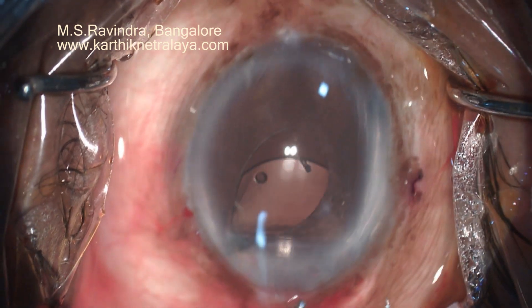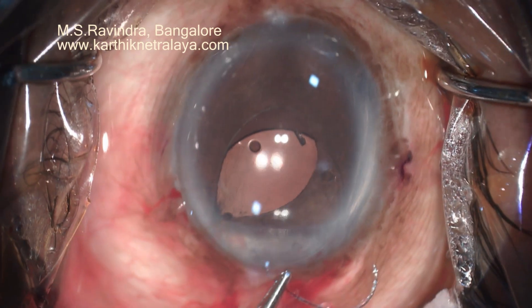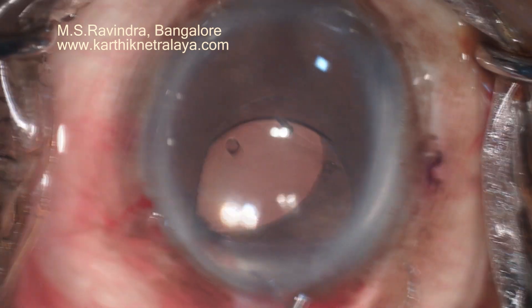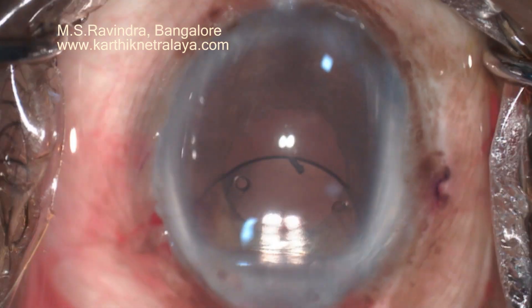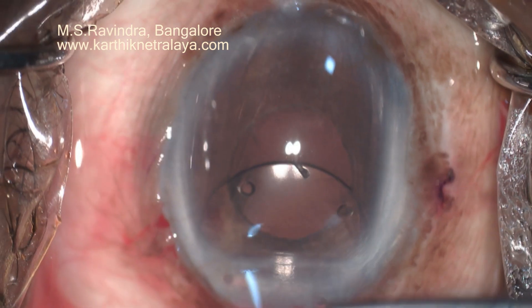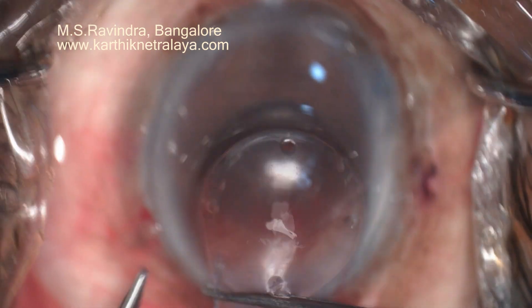You can see the four positional holes in the lens. The inferior haptic is not to be seen. In those days it was made of prolene sutures, and it is missing — only the stump inside the PMMA is there, but outside it's missing.